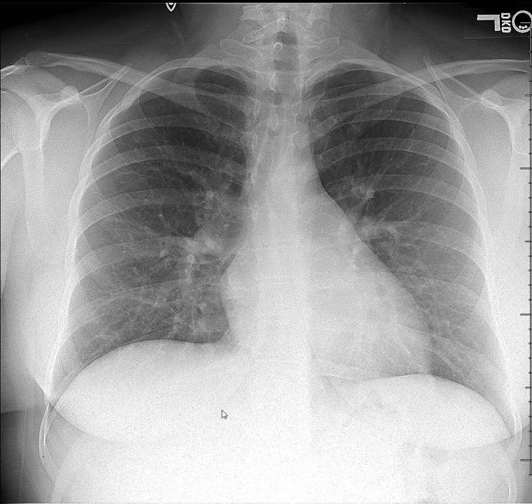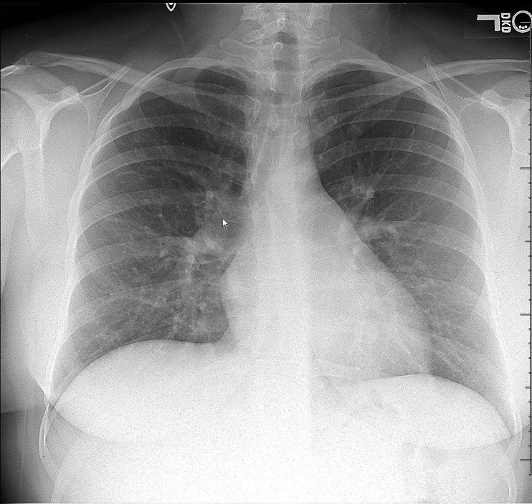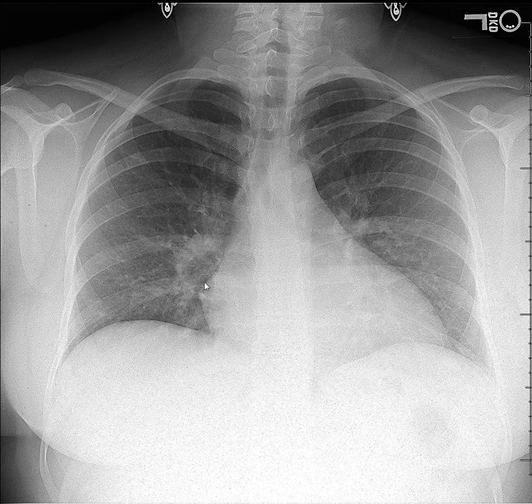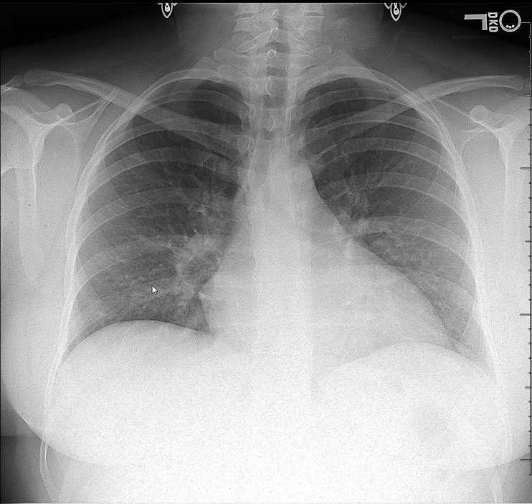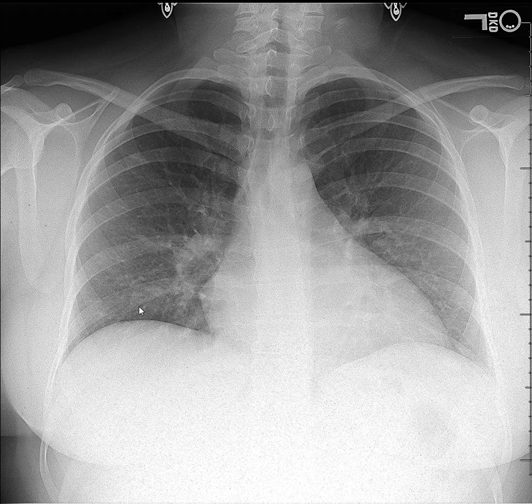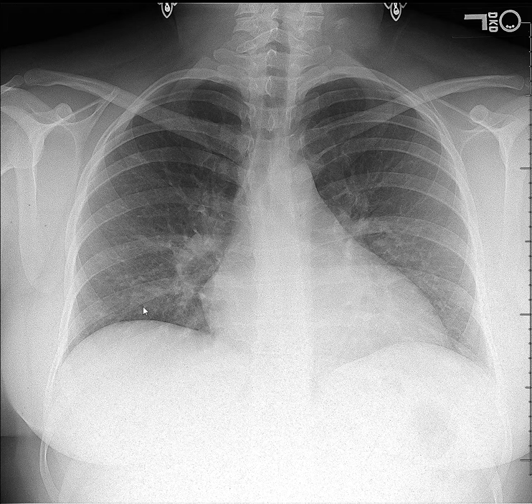Therefore, the difference between adequate radiograph technique and a patient who did not achieve an excellent inspiratory result is the difference between calling that possible disease versus no disease. The accuracy of acquiring the data is important — if we are fed poor data, then a poor and inaccurate conclusion may result.